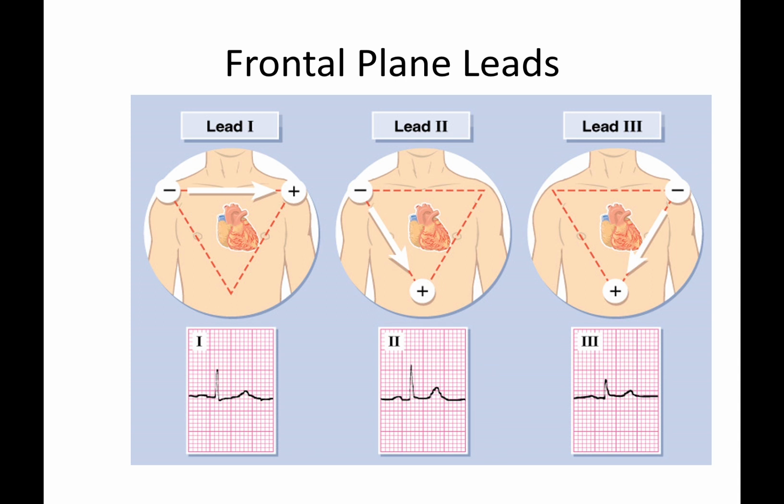We can then take that, pull it out further, and say, how would the same heartbeat look from all of these different leads or vectors? Because that's all these leads really are. They're measuring the vector from their particular angle on the heart. And what we start noticing is a pattern develop: leads that are looking at the heart from the same area create EKG rhythms that are very similar.